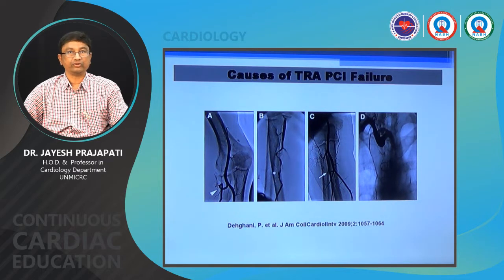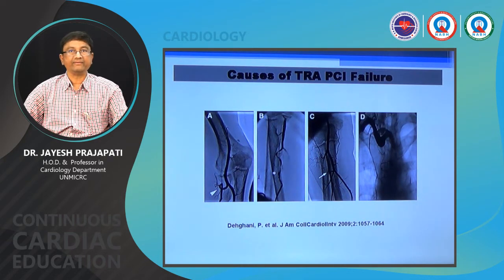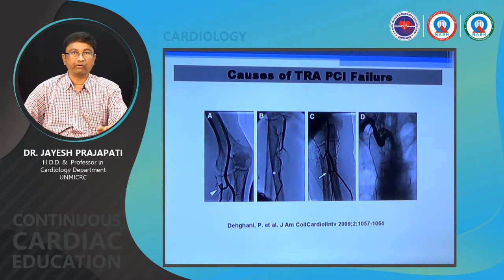This is sometimes dangerous. You require more experience. Then what happens is your wire goes into the descending aorta, and then you have to get into the ascending aorta. Sometimes it is difficult, so then you have to go with an LAO view. Tell the patient to take a deep breath. Sometimes you are not able to go. So tell the patient to do this; it is a very excellent maneuver.